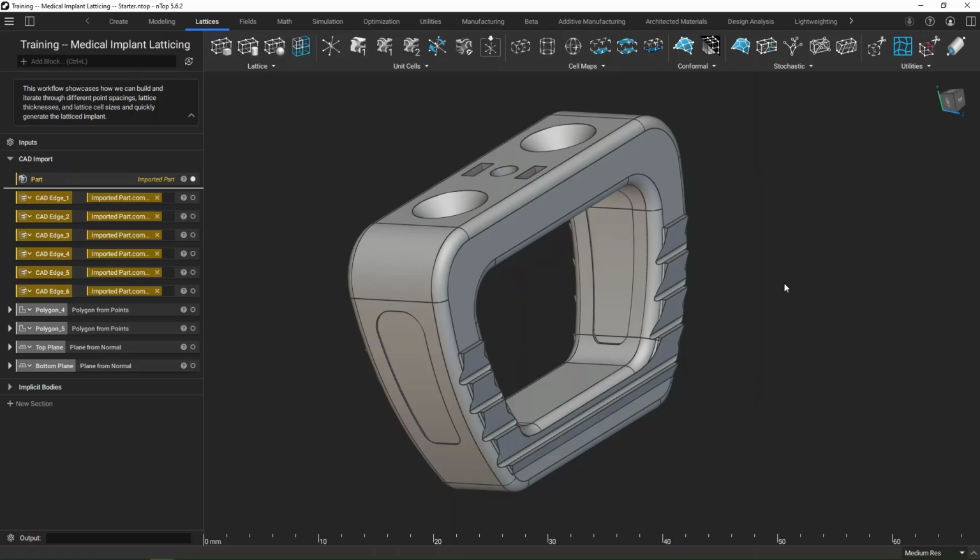If you're familiar with the typical CAD to nTop workflow, typically we're in CAD creating that initial geometry, defining the different design spaces as well, and bringing that into nTop. So we can see that's mostly done here.